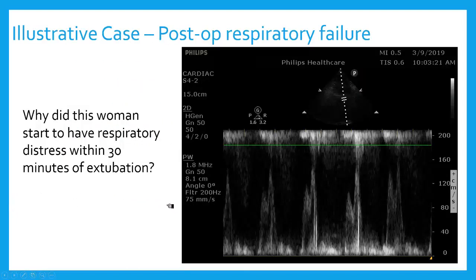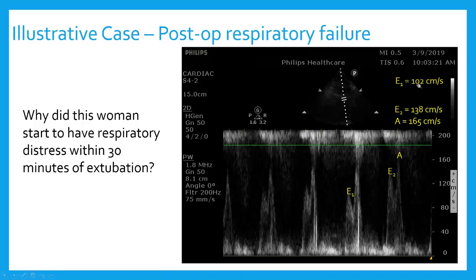We're going to go through some cases now using simple diastolic parameters and how we can use this information to help manage patients. Here's a patient that had post-op respiratory failure — she was in her 70s. A nurse practitioner extubated this patient, and she started to go into respiratory distress about 30 minutes after extubation. I had some diagnostic hypotheses, but when I threw the probe on her I had a pretty good understanding right away. We have an E-velocity of up to 138 and an A-velocity of 165 — these velocities are absolutely through the roof.